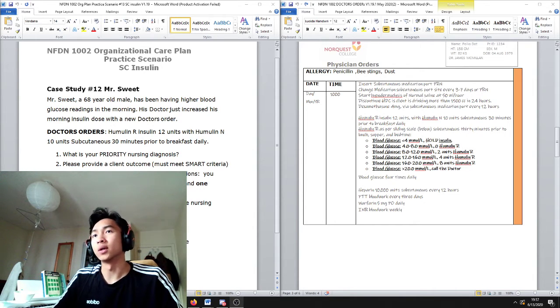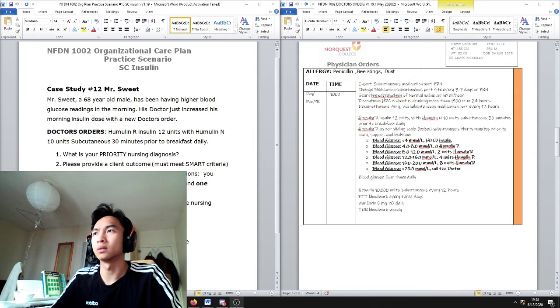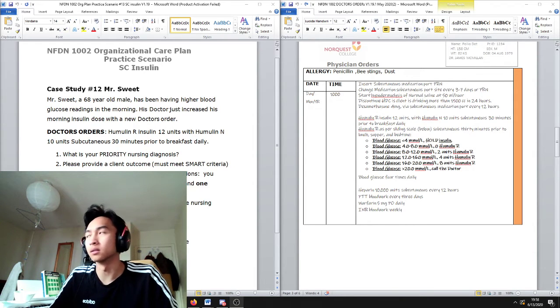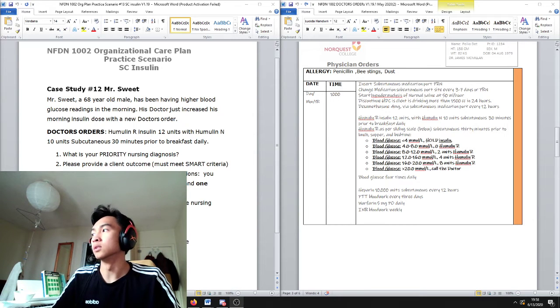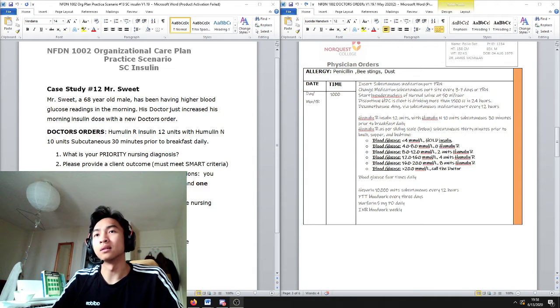Next is to adjust the height of the bed and the side railings for your comfortable preferences rather. Sorry. Next thing you need to do is to do assessments prior. So for insulin administered subcutaneously, I would assess the lower abdomen area because insulin absorbs faster there.